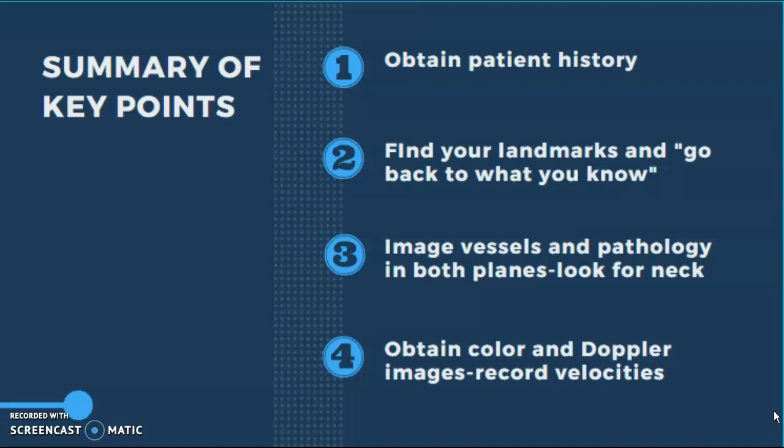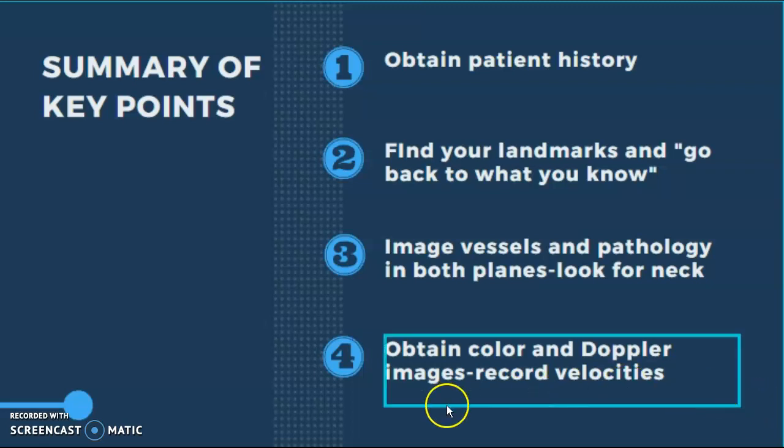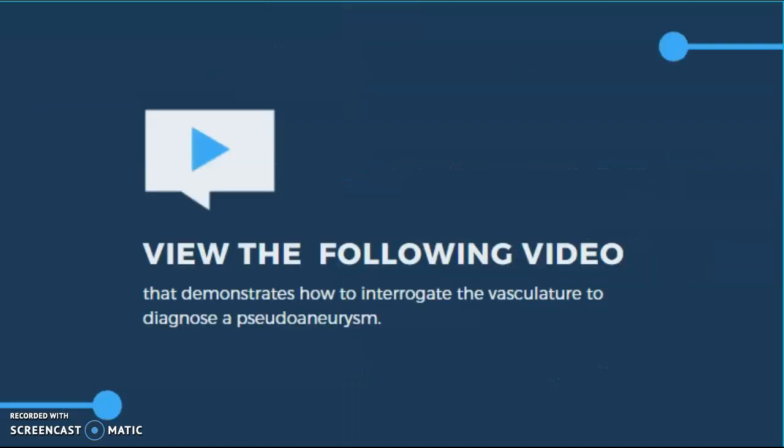That's very important. You have to have a neck to actually feed the pseudoaneurysm, and also obtain color and Doppler images and record velocities. In the following video, it will demonstrate how to interrogate the vasculature to diagnose a pseudoaneurysm.